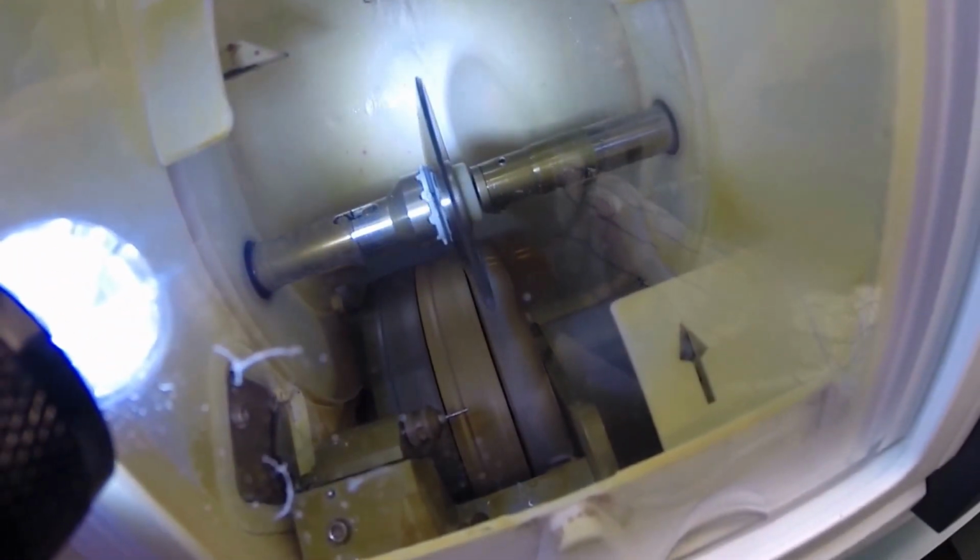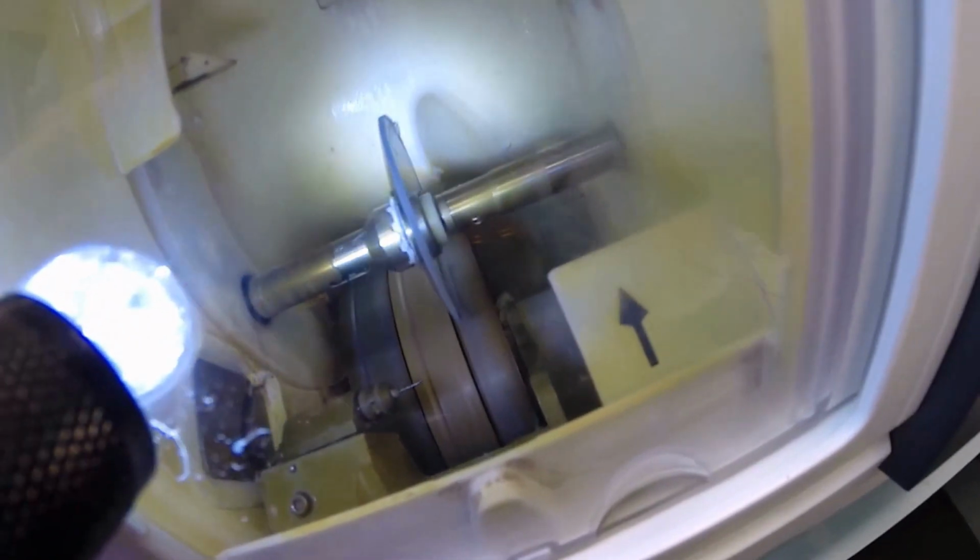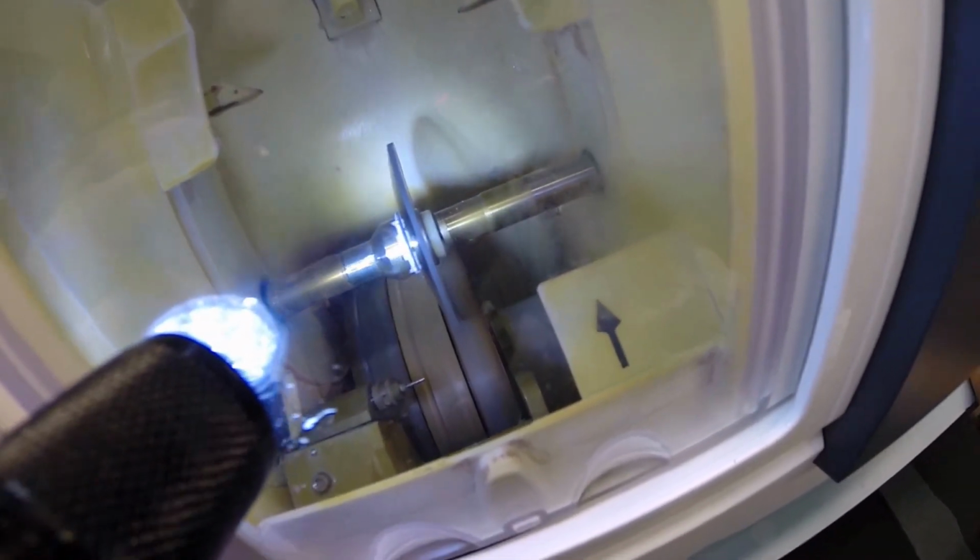Now if you see light flickering in the background, that is water to catch the optical sawdust as it comes off of the cutting wheel. Polycarbonate lenses cut dry, where plastic and high index plastic and Trivex cut wet. Water will spray onto the lens for the last 20 seconds of the cutting cycle to wash away the optical debris that you see beginning to form on the edge of the lens now.